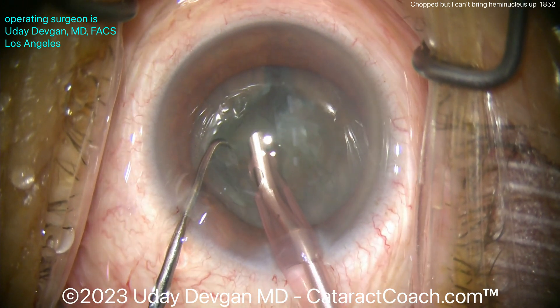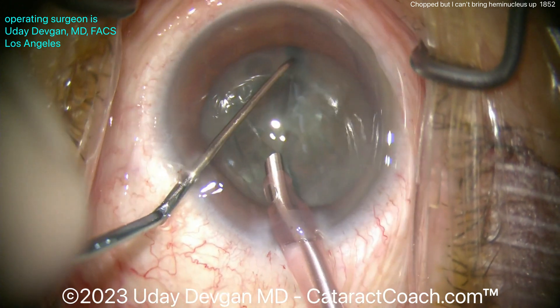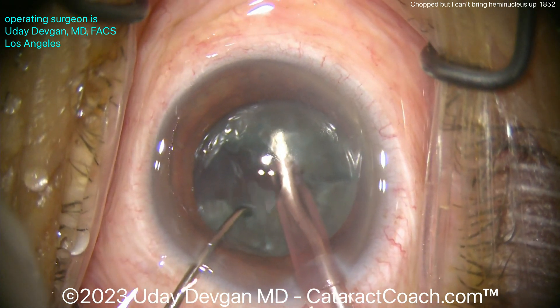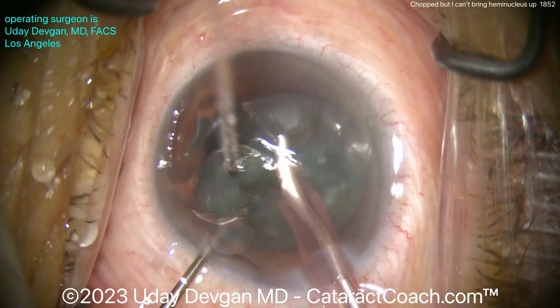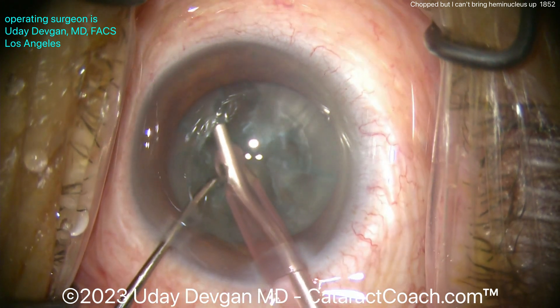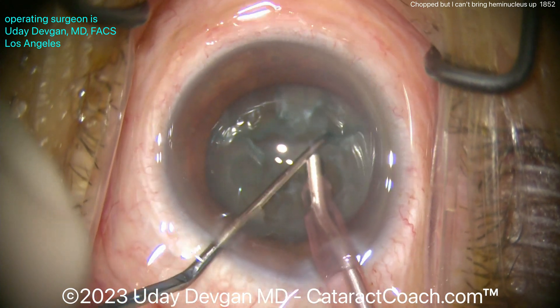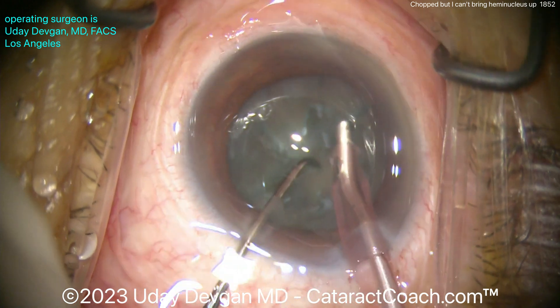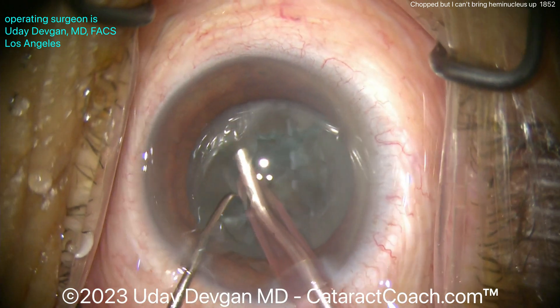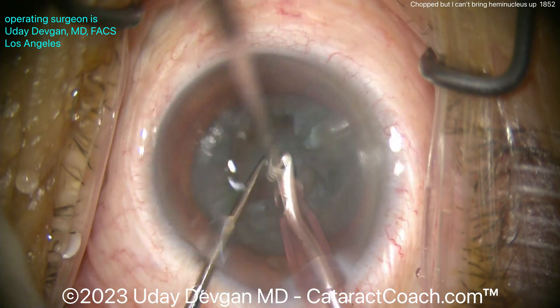I'm going to rotate it around again, get this corner, and maybe I can just aspirate — buzz it in just a little bit, bring it up. It doesn't want to come up. Try again. What's the issue? Well, the two hemi-nuclear pieces are not fully split — they're still attached at the bottom. I think the chop propagated through now. I'm going to spend some time to make sure these halves are really split.